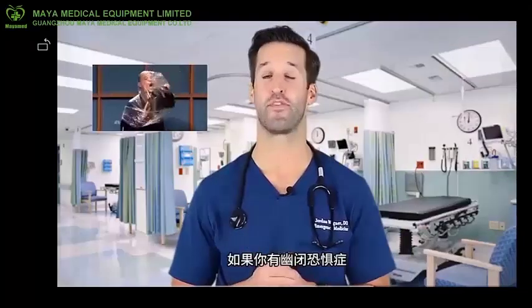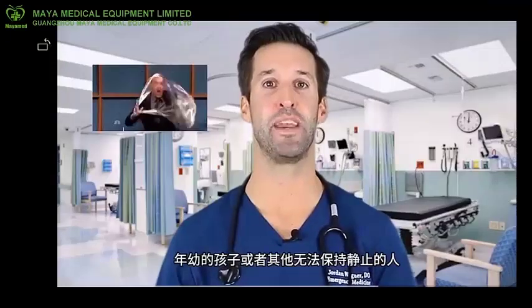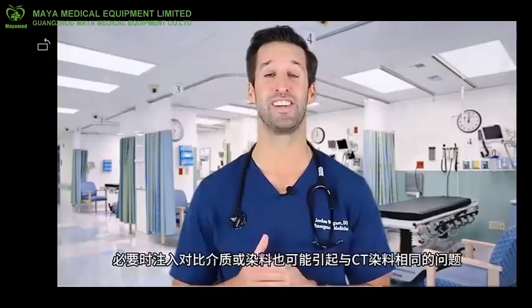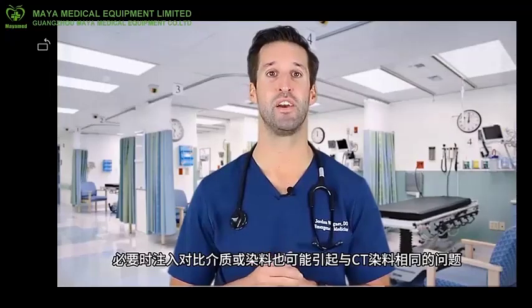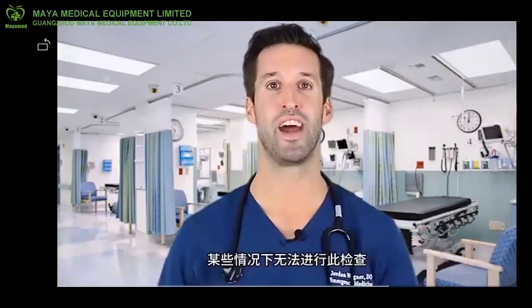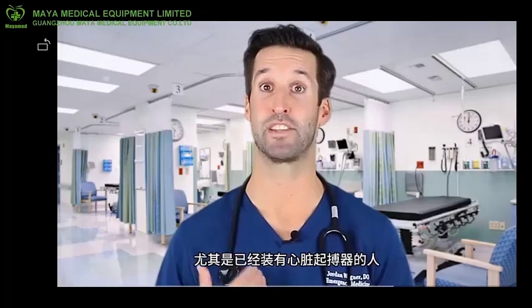If you're claustrophobic, this study might not be good for you. Sedation and anesthesia may be required for young children and others who just can't remain still. Injection of contrast medium or dye, if needed, can also cause the same problems that the CT dye can cause. This cannot be undertaken in some situations, especially for people who have a pacemaker in place.